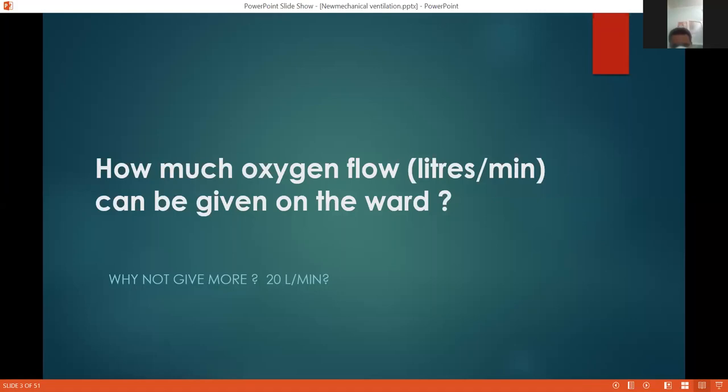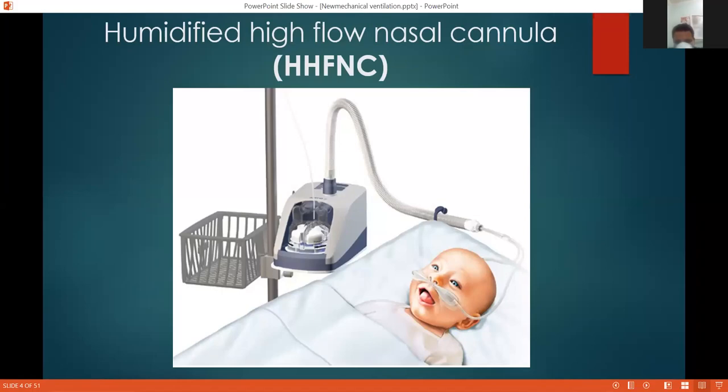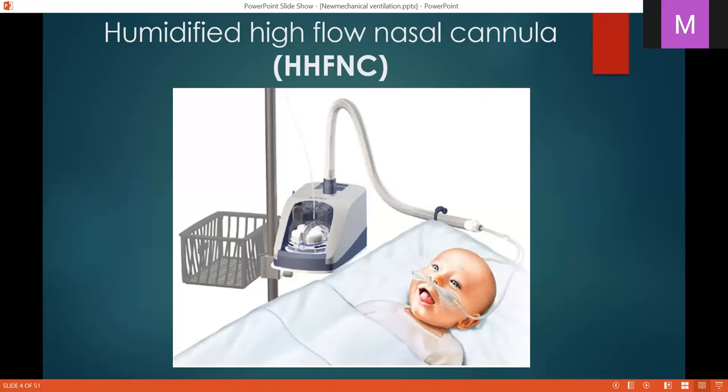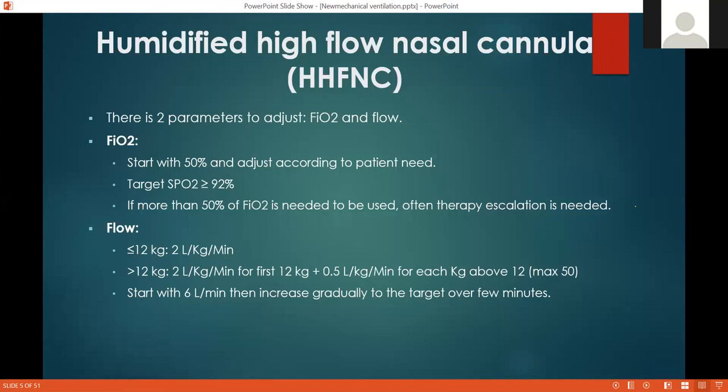So this is the idea behind this machine — you can see it beside this patient. It's a very famous machine to provide what's called high-flow nasal cannula therapy, called AIRVO, the most commonly used one; some places call it the Optiflow. The idea behind the technology is to give a very high level of oxygen flow above the peak inspiratory flow, but with adequate humidity and adequate temperature.